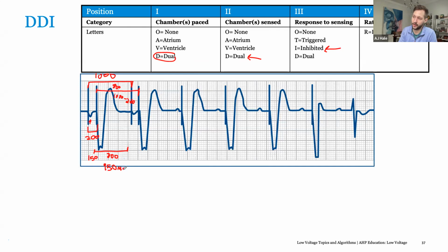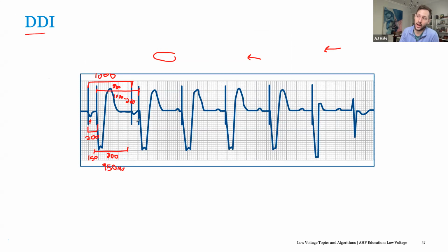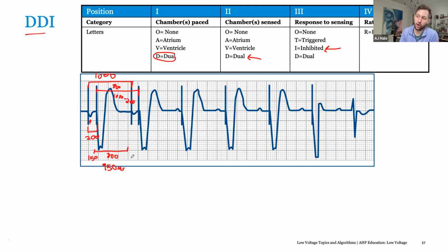And everyone's like, why does this matter? Because you'll see it won't make as much sense if you don't know what's occurring. So just remember that DDI is a modified ventricular based timing. It's basically VVI adding atrial activity as well. Elvis, this is going to matter to you when you take the test, because they're going to ask you, why did this atrial pace occur earlier than 1000 milliseconds? Why did it occur at 950? When you take the IBHRE, that's why, because it's ventricular based timing. I know that is kind of weird and complicated. So if anyone has any questions, let me know.